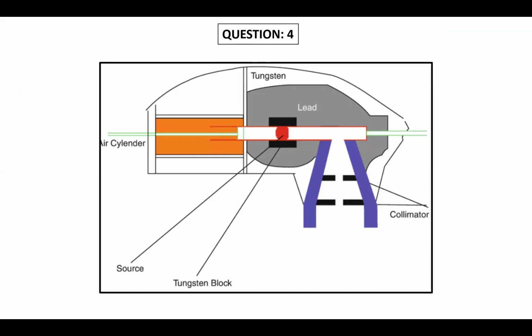What we can see here is the source head, the collimators, which is covered by the tungsten hood, sir. It's not a tungsten hood, madam. Oh, this one you are talking about. Okay, yes, sir. In this image, the source is in the off position, sir.